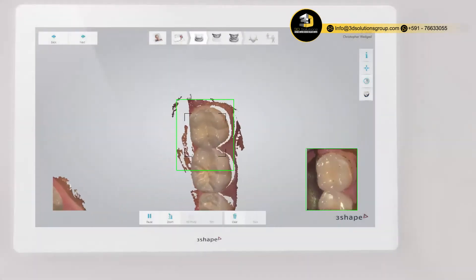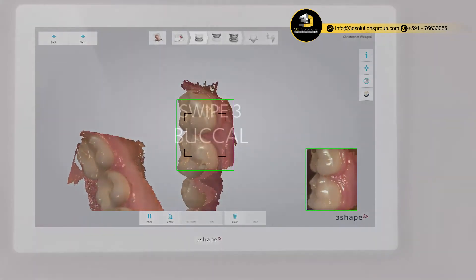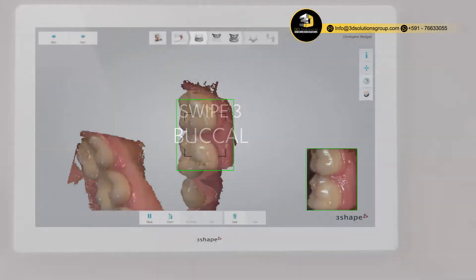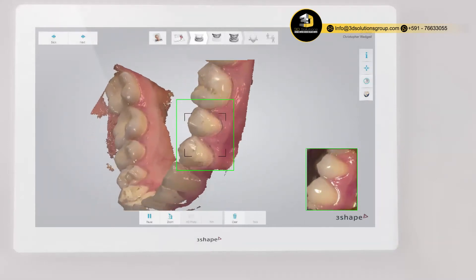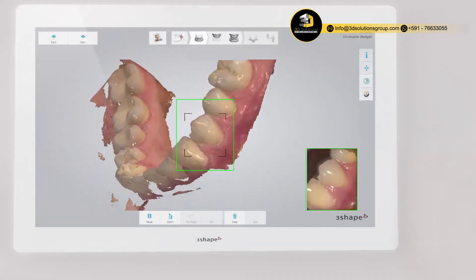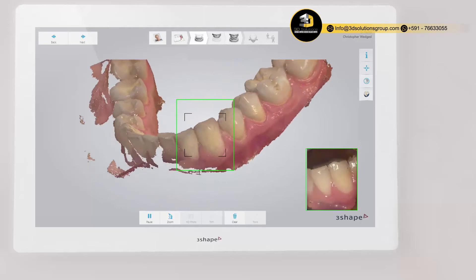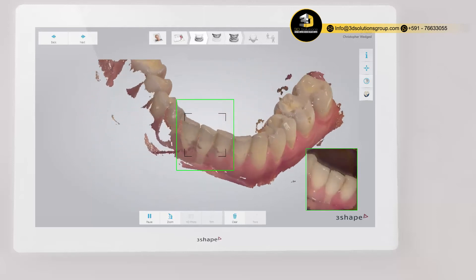Go along the lingual surface of the whole arch until you reach the last molar on the opposite side. Then roll to the buccal side and complete the buccal swipe, going along the buccal surface of the whole arch. Use your finger to keep the cheek away.